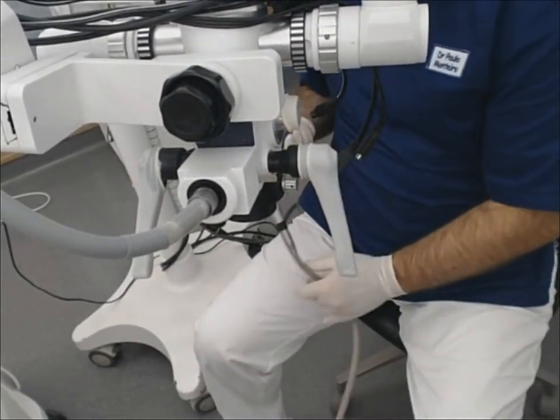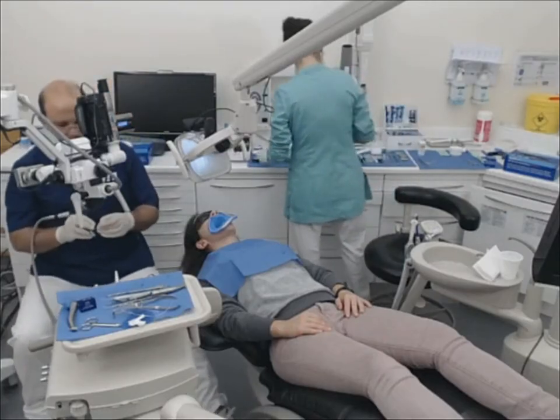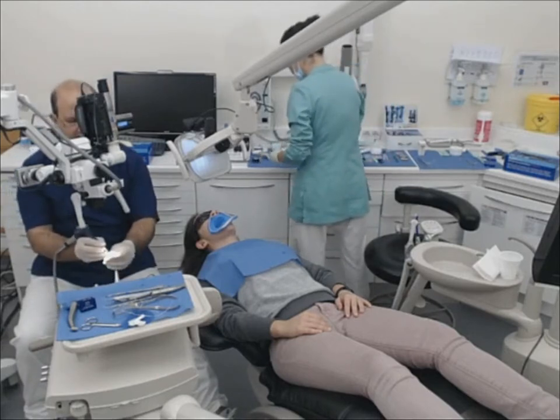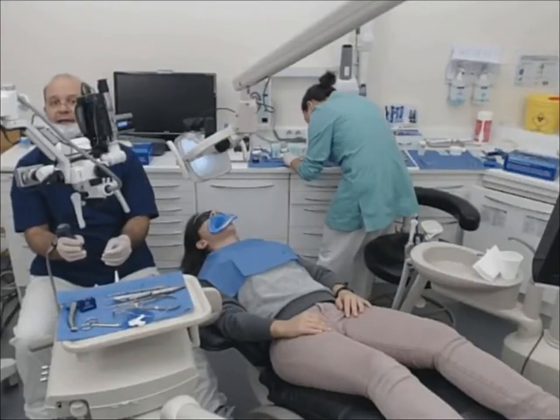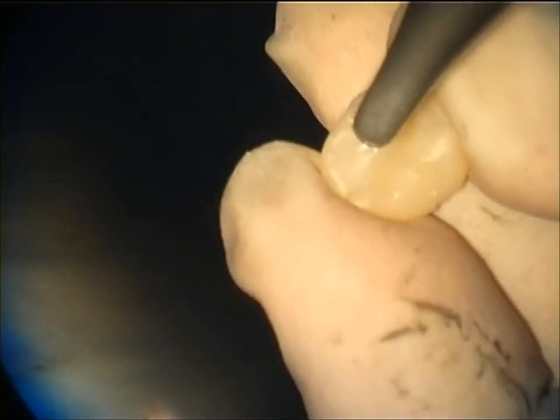So the first step, if you want to make some characterization, is you should sandblast or make some roughness on the surface you want to apply it to. But you ask me, why are you polishing and then going to sandblast? Okay, I'm just going to sandblast the area, then I'm going to apply the tints, okay? The other surface I'm not going to sandblast, so it maintains the polish. So I'm just going to apply a little bit, okay, just a little bit on the occlusal surface.